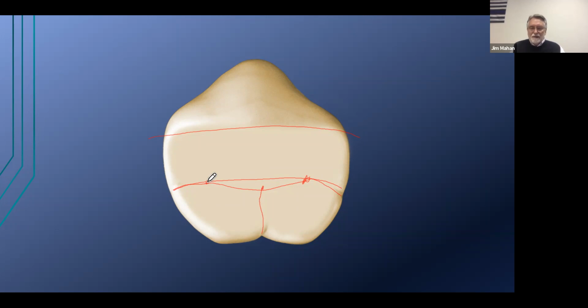This is something that PTC does for clarity, and I think it really is a solid concept. Marginal ridge grooves are exactly the same on every tooth that you make, so why not differentiate them from a cusp ridge groove? That marginal ridge groove goes back in an elongated S at 45 degrees to the marginal ridge. Again, go here, here, and now we're going to do the cusp ridge grooves. What guideline do we need to do a cusp ridge groove? We need to know where the cusp ridge is.